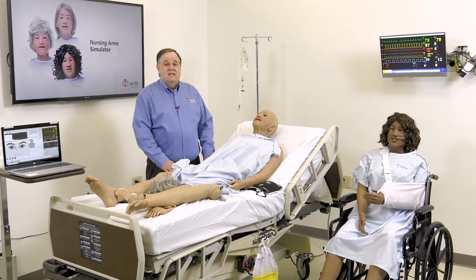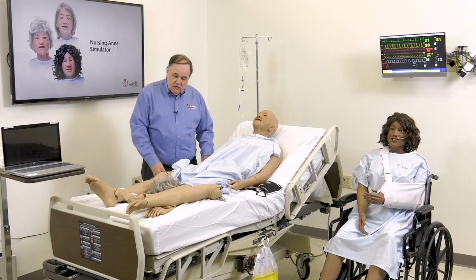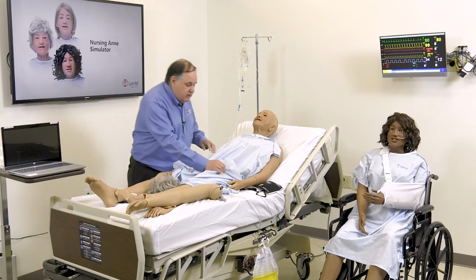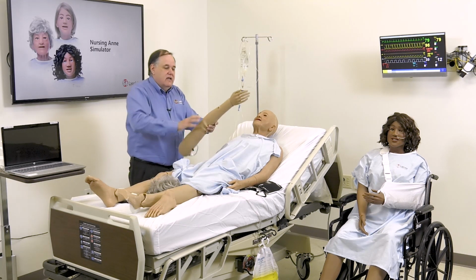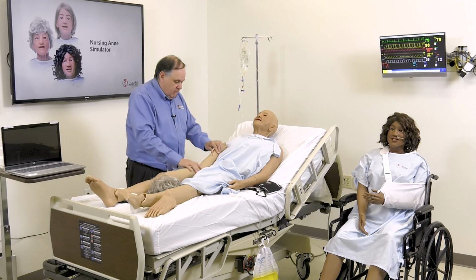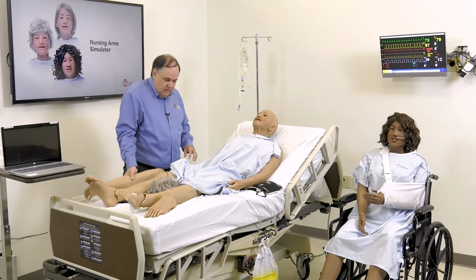We'd be happy to get into details about that if you'd like us to follow up and send you more details about that. We've had a few questions on injection ports, I believe, in her arms. Could you just show them and where they are and maybe demonstrate if possible? Sure. So she comes with a pre-ported IV. So I'm going to use her arm that's sort of disconnected, and maybe we can sort of, actually with the geriatric one, I'm going to show you actually maybe on this side.